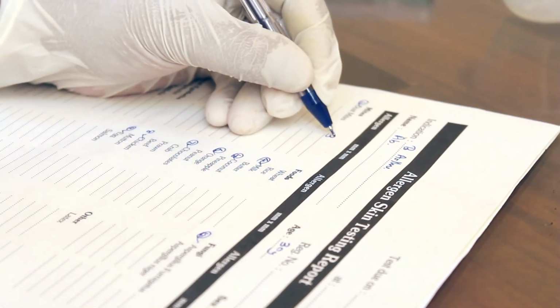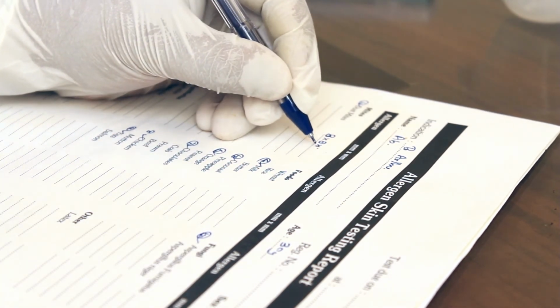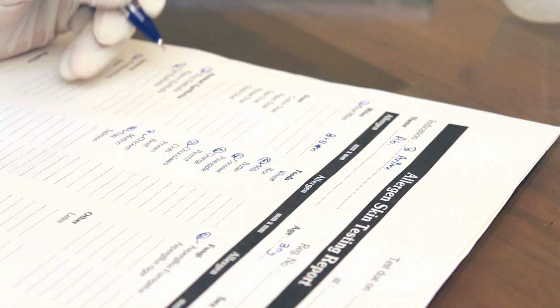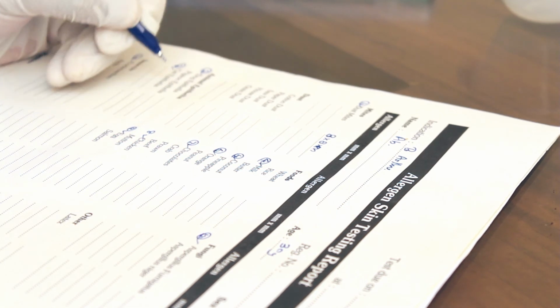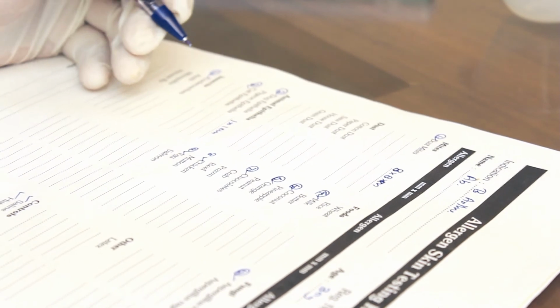To enter the data in the form of reaction sizes, after measuring each size of reaction, it is entered in this sheet.